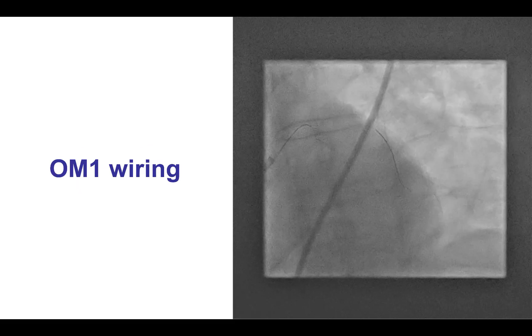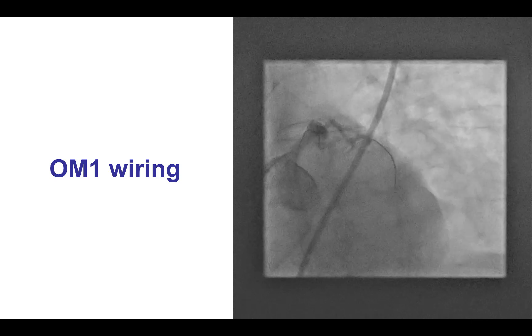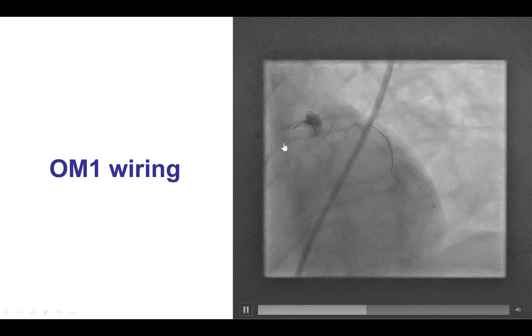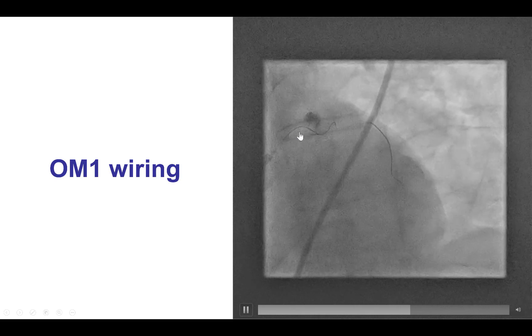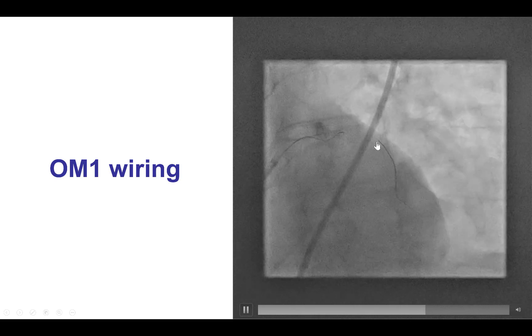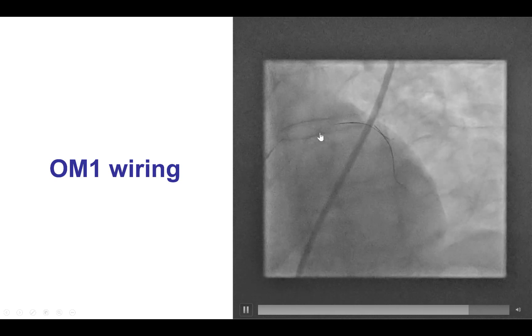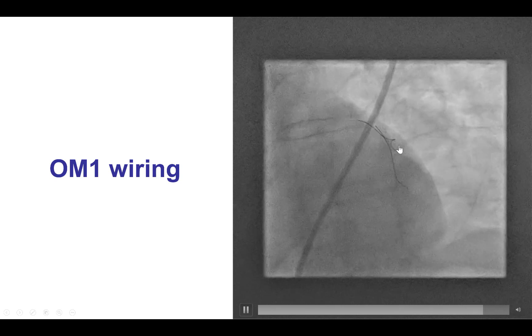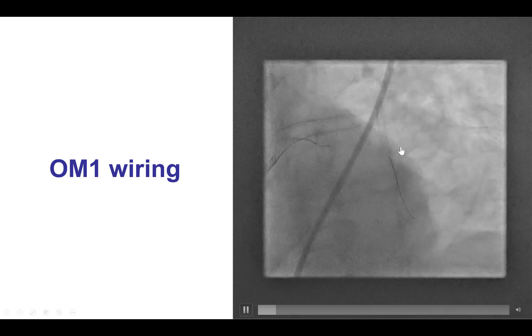Of course, now we have to advance a guide wire into the other branch. Now the advantage is that the original guide wire is to some extent straightening the angulation, and that enabled a second Workhorse guide wire to advance into the obtuse marginal branch.